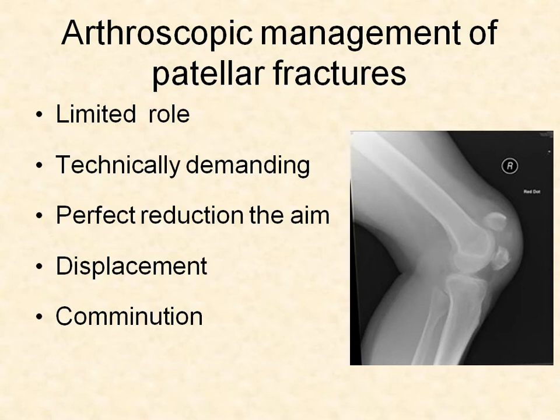It may have a role if you're wanting to investigate a fracture that appears to be minimally displaced, but you want to be certain that the joint surface is congruent. But to treat a fracture like this arthroscopically would be technically very demanding. You have to bear in mind that the whole joint is open, you can't contain fluid within the joint.